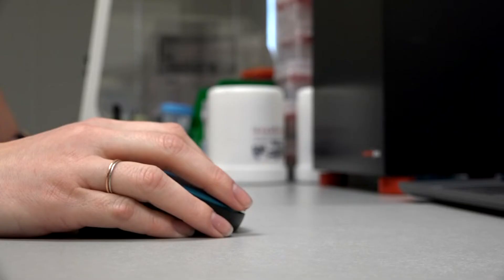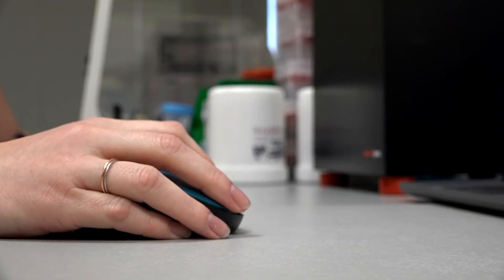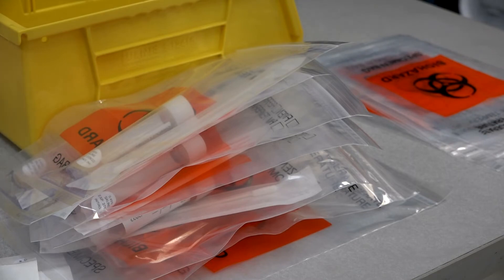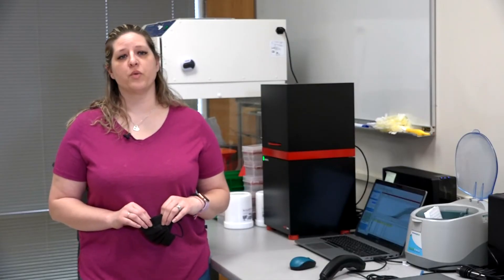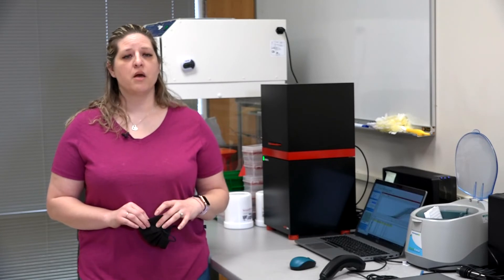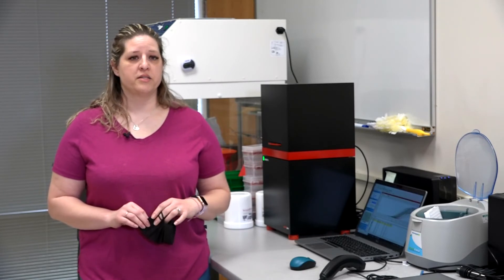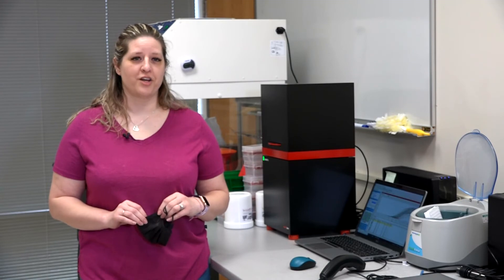Lab manager Joyce McLeod says incorrect or inconclusive results are typically because of the way a sample was collected. We always now have people blow their nose prior because we're ending up with a lot of mucus on our collection devices. And that is actually not a good thing.